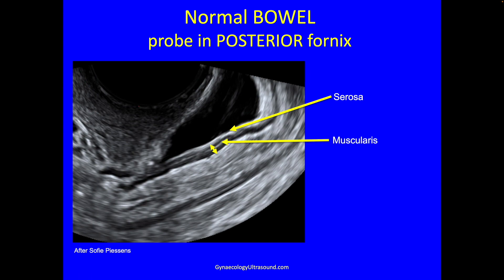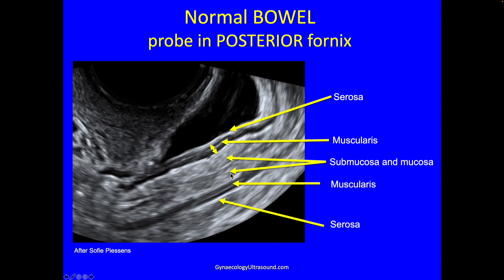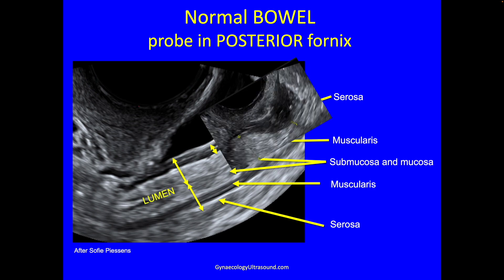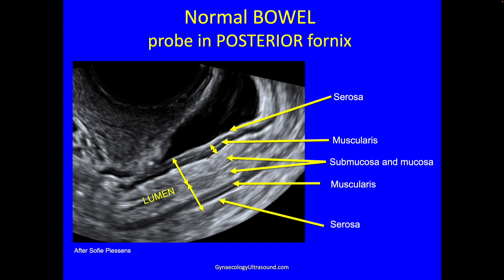The outer white serosa and the triple layer of muscularis — the dark-white-dark layer. The outer layer is longitudinal muscle fibers, some fibrous tissue, and the inner circular fibers — the muscularis, the most important layer here. Then we've got submucosa and mucosa together, and again muscularis and serosa. So this is the anterior wall, posterior wall, and that's the lumen. The muscularis layer is the most important layer.